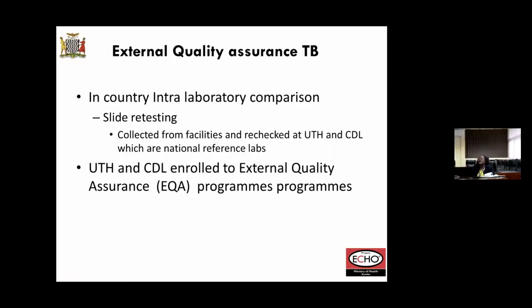For external quality assurance for TB, we have two programs that we use. We use an in-country intra-lab comparison program where there's slide retesting. And the program actually collects samples from facilities and rechecks them at UTH and CDL. And that's how results are given back. And basically, they're just rechecking. Whatever slide, if you said it was negative, we're going to recheck it from our peripheral laboratories. And if you get it right, if they find the same results as you, then you have clearly passed.